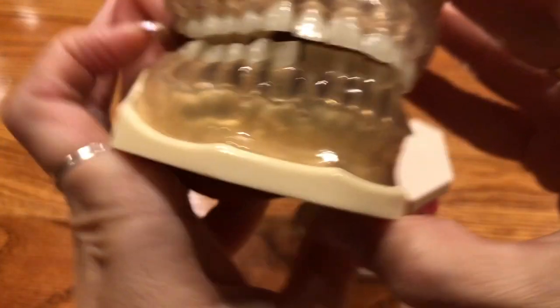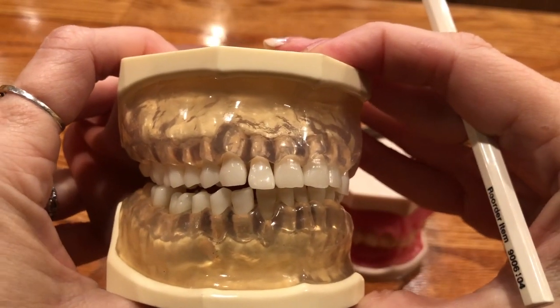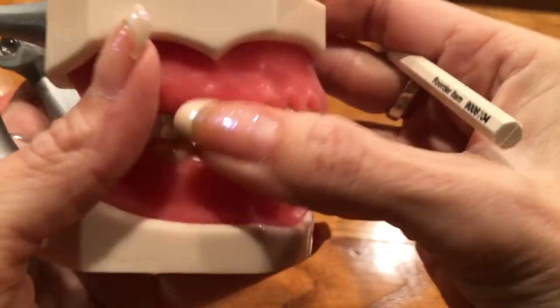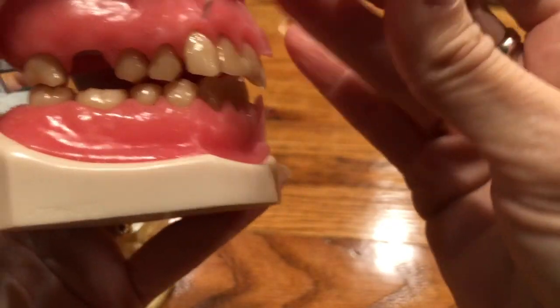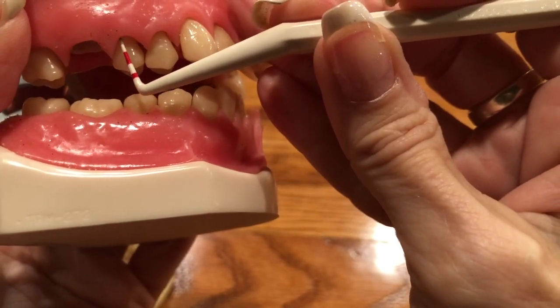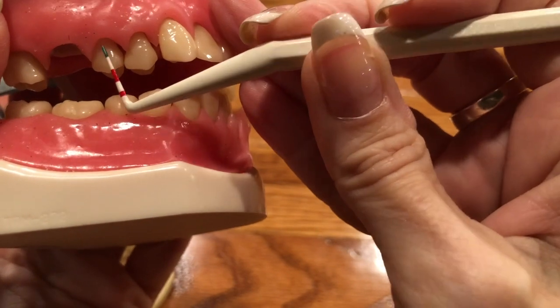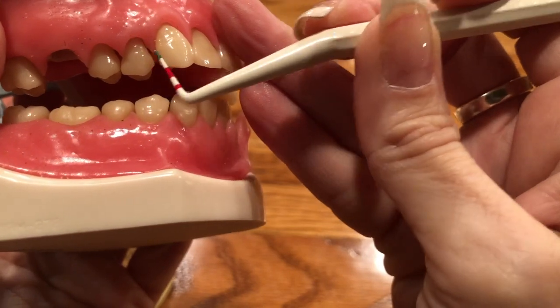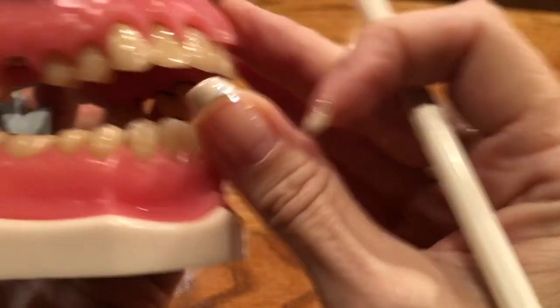4. Okay, so you get the point of what it looks like when you're measuring the gums and what you're doing. So this is more what your teeth look like, and that you have gums and we cannot see below there when we're measuring. And so we're using this probe and just kind of blindly taking this probe until it stops and lets us know how deep that is. And this is why it's important that you know that.